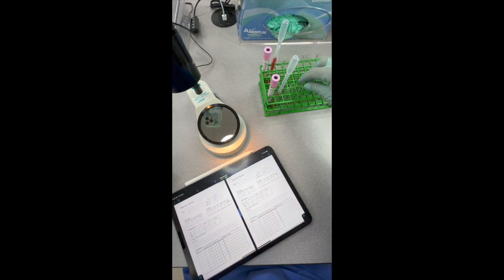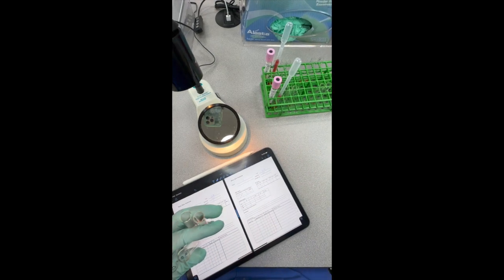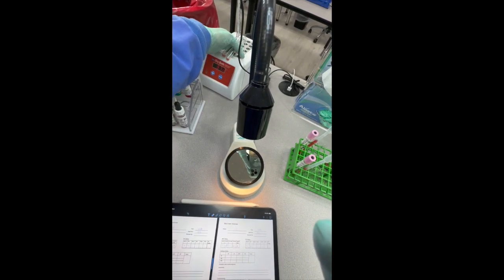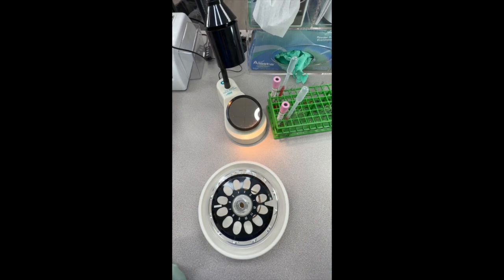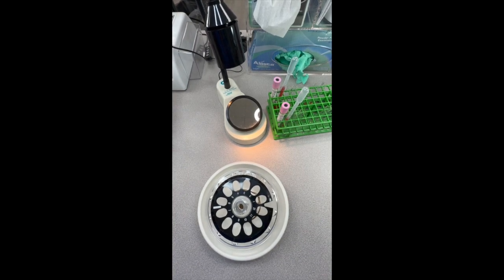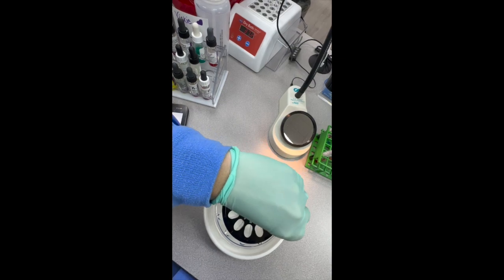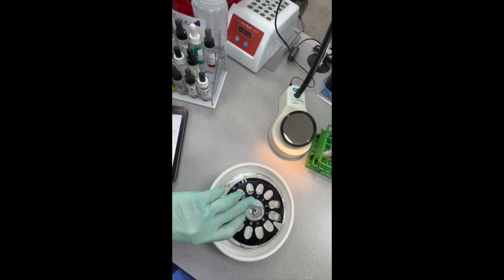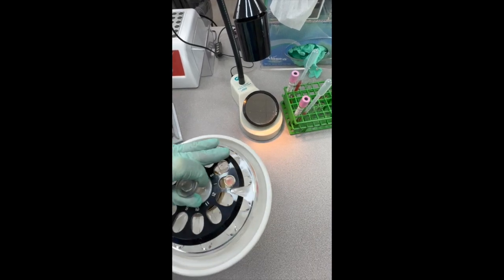And I have my incubator on. So we're going to put our D and our D control for both of those specimens back here in our incubator. Okay. Set our timer for 20 minutes. And we'll be back. Okay, time's up. We're going to get our tubes from the incubator, put them, 1 and 2, into our holder here, put them into the Serofuge, 15 to 20 seconds. We'll be right back.